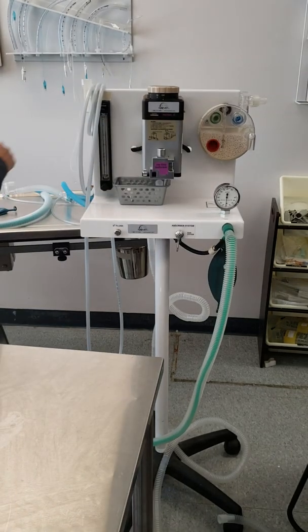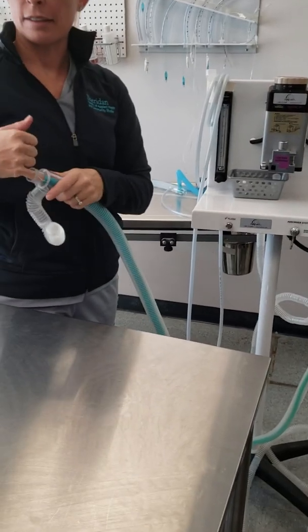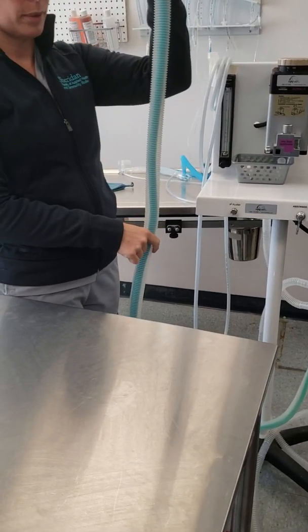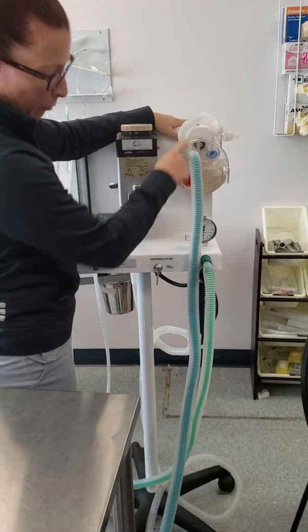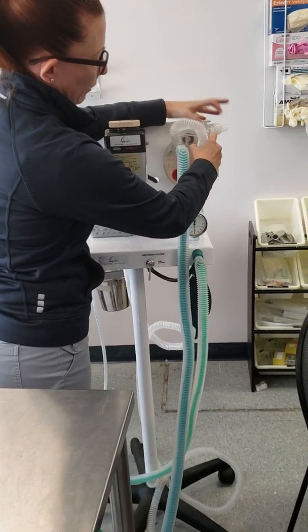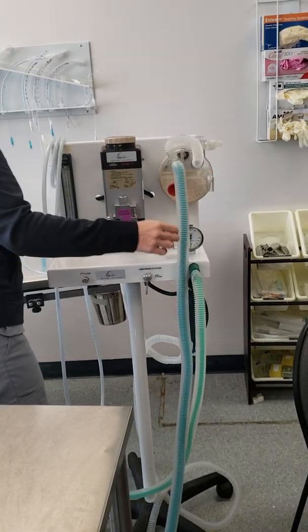So from here, I'm going to take my F circuit, and the inside of my F circuit here I can see feeds into my colored or my blue or green tube. That's the one that our fresh gases pass through that our patient breathes in. So I know that needs to attach here and match that one. Patient breathes in, they exhale through the clear corrugated tube, and I know the garbage tube needs to be close to my garbage pieces, which is my scavenge and my pop-off. Okay, bag hooks up here.